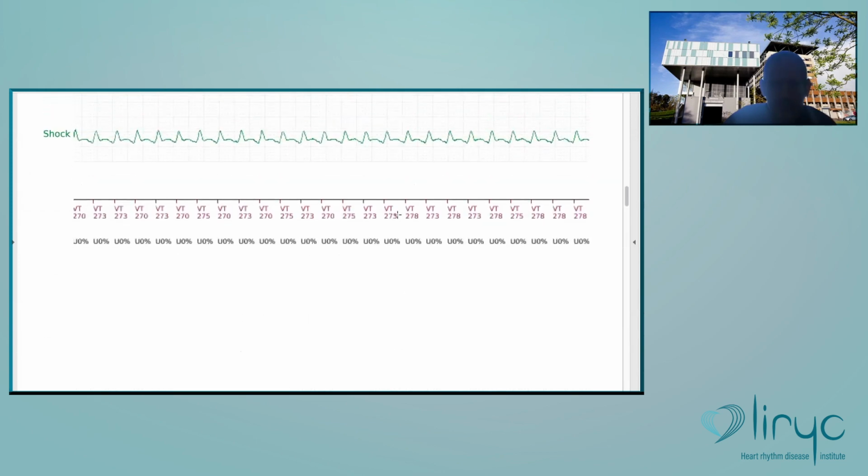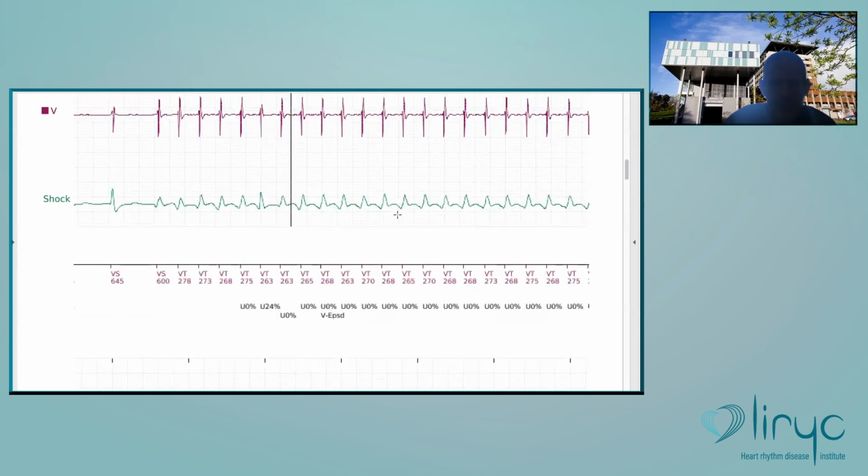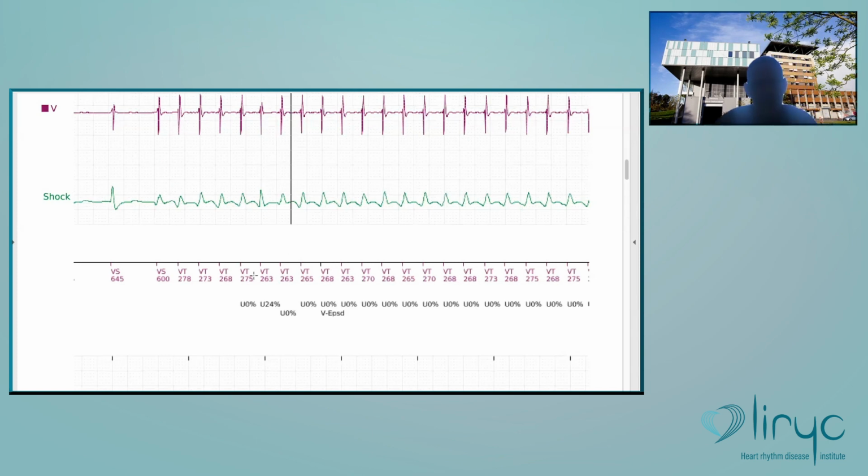Now if you consider the analysis of the morphology of the signal here, the first analysis is at the 4th rapid cycle. You see the first 3 say you enter an episode of arrhythmia, and at this time we start the analysis of the morphology. As you said, the U means uncorrelated.